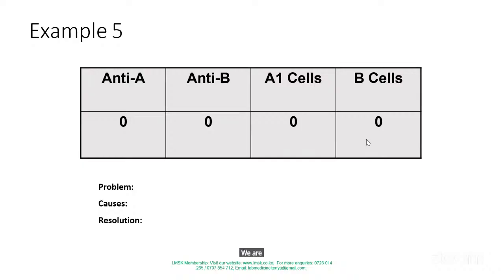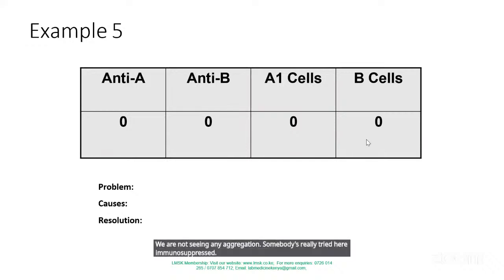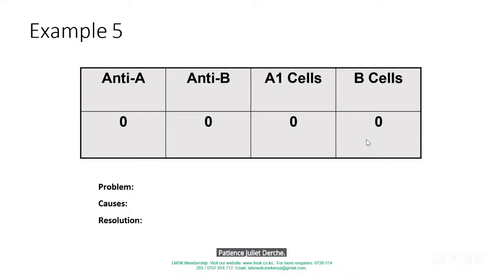We are not seeing any agglutination. Somebody's really tried here, immunosuppressed patients. Juliet Deche, good. Mulongo. Timothy Kiplagat, that's a good trial. Okay, good, Stephen. Good. Ben Ngare, good.